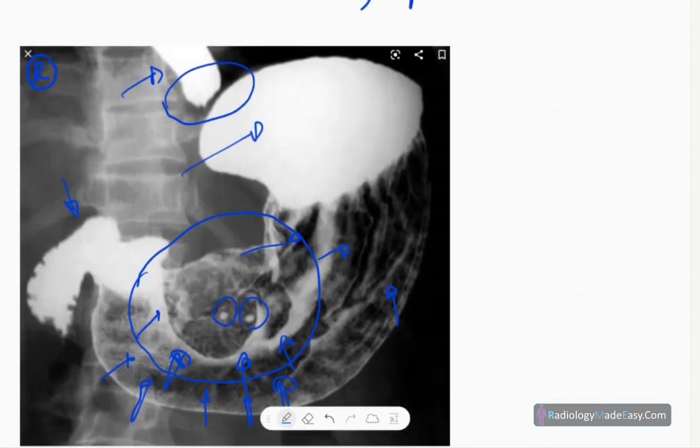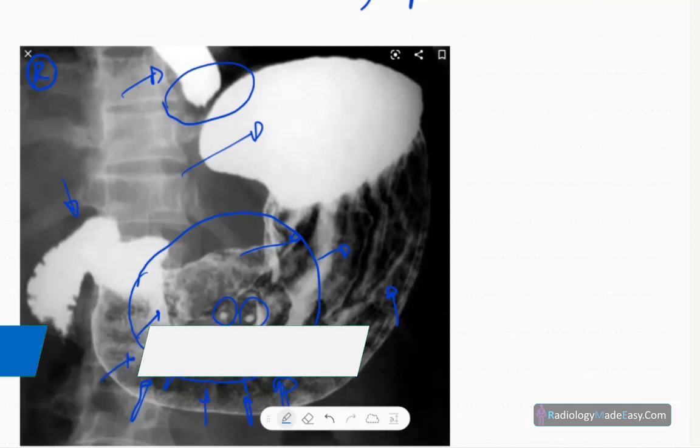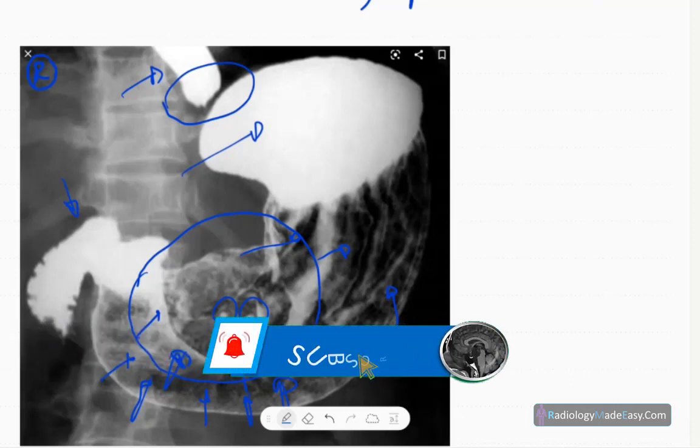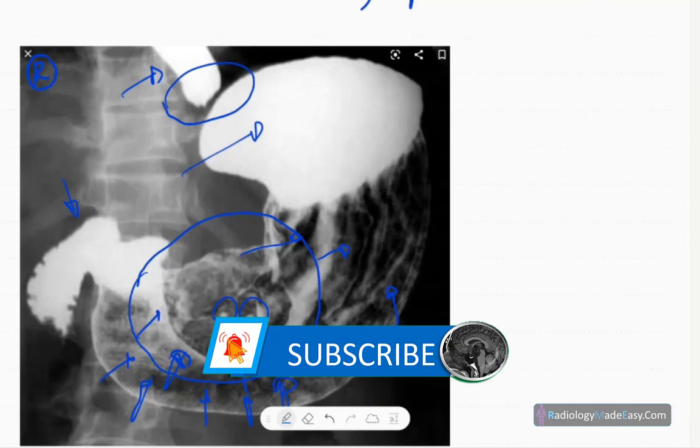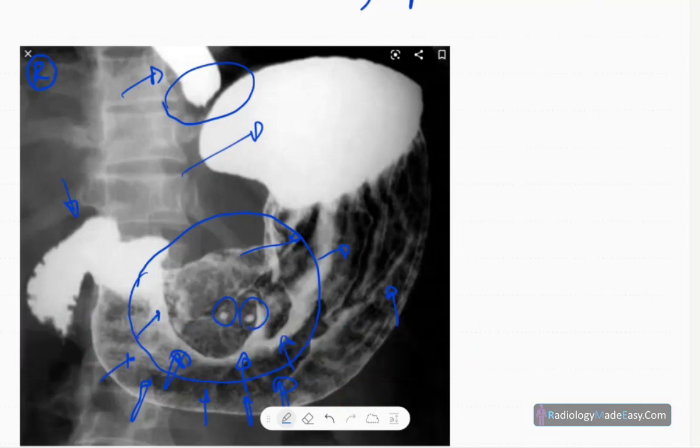Gastric lymphoma occurs in patients above 60 years of age, and it can be primary or secondary. Secondary means lymph node involvement in the body, so Hodgkin's disease and non-Hodgkin disease. But this one is primary gastric lymphoma.